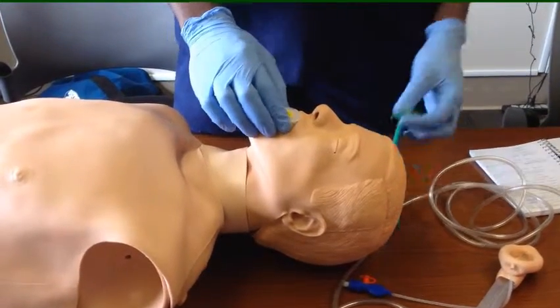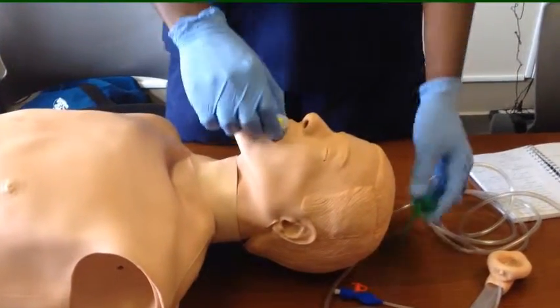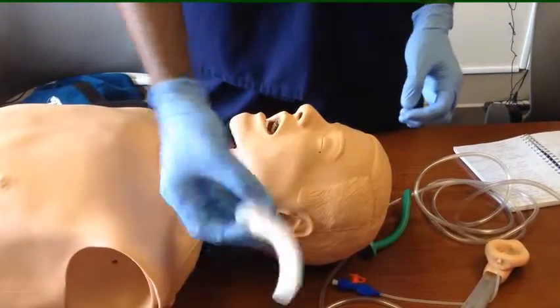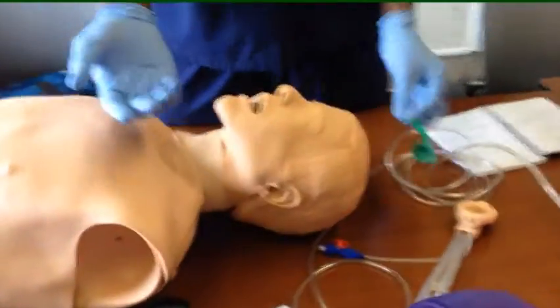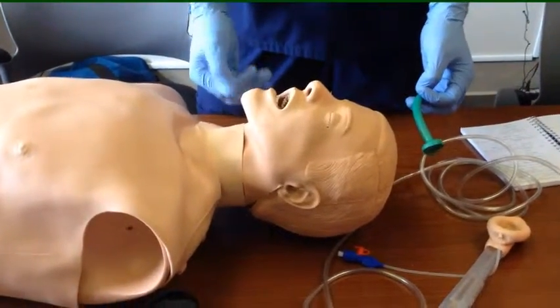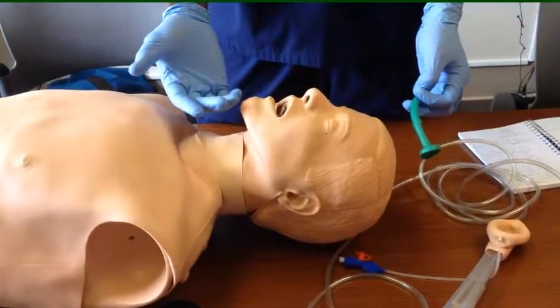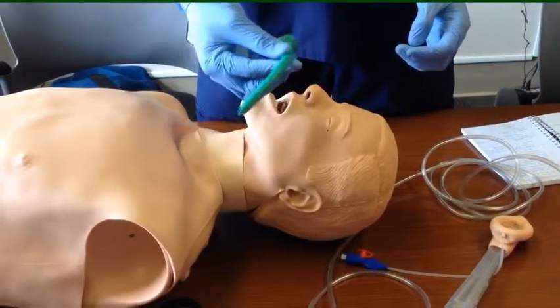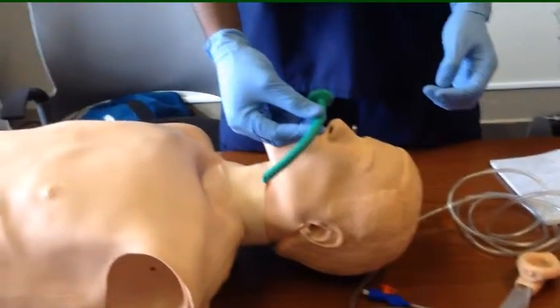Now I'm going to demonstrate how, let's assume this is out. Okay, I'll take it out. Now our patient is back, is conscious, and is talking. We don't need it anymore. But now maybe it's calling again, and this time our patient still has a gag reflex, and maybe is a little bit semi-conscious. In that case, we may have to use the NPA, nasopharyngeal airway.